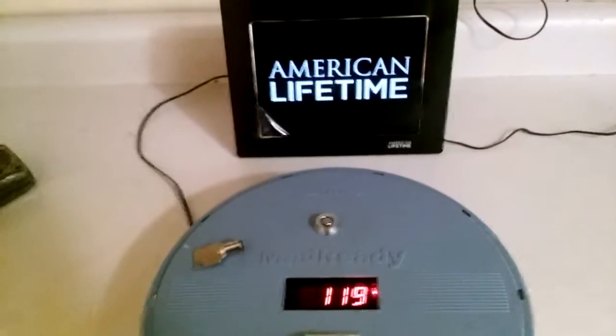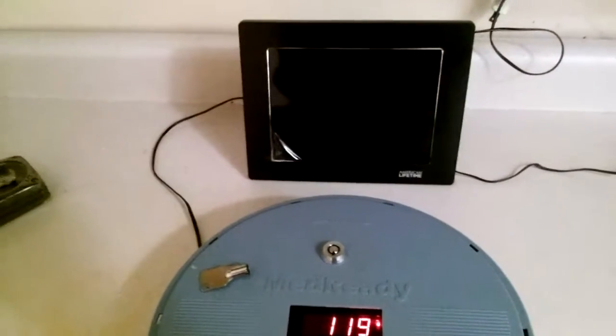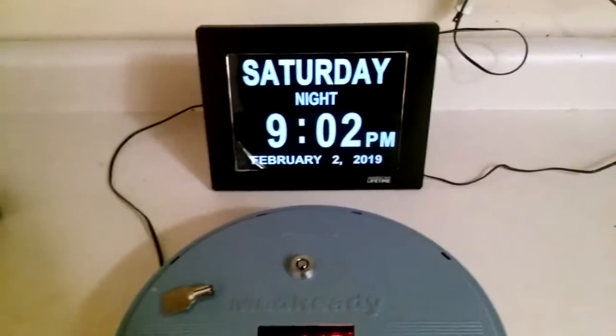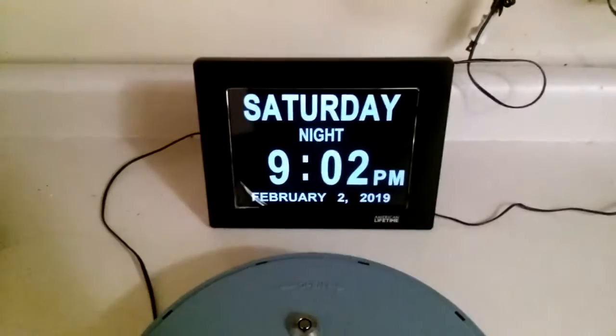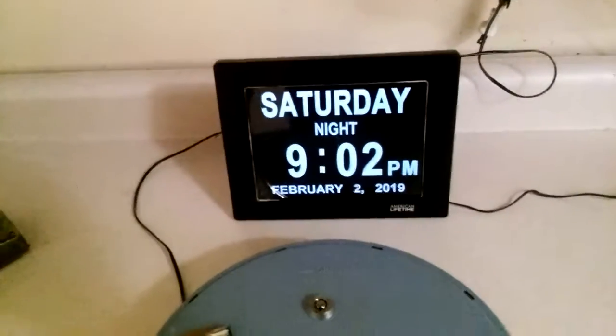A way to alleviate that is to buy a little battery backup device for a home computer - they're like 30 to 40 bucks - and that'll keep it running for hours. This clock is about 50 to 60 dollars in a store. I got this one a little over 30 bucks in a damaged box on eBay.